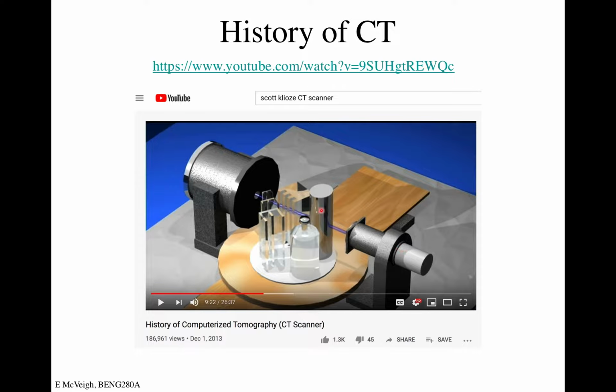And so essentially it's like a SPECT scanner in a way, right? It's a nuclear source and it goes through here, but it's a fine beam because he focused the beam down. So what he did was this tray of material rastered across the beam, and then he rotated the tray and then rastered it back and rotated the tray and rastered it back. And it took about 2 hours to collect everything because the amount of radiation coming out of here wasn't very high. So you had to pause and collect data for a little while.